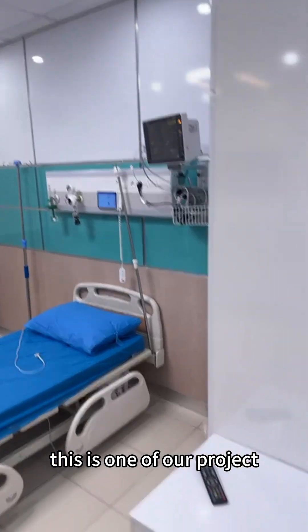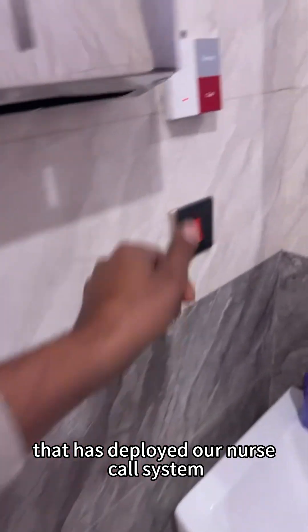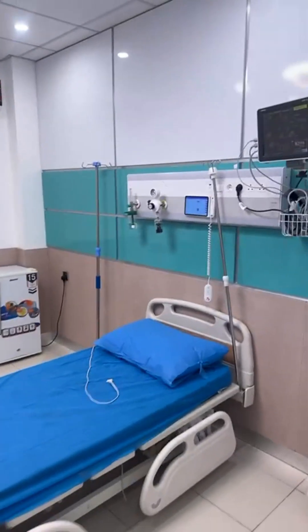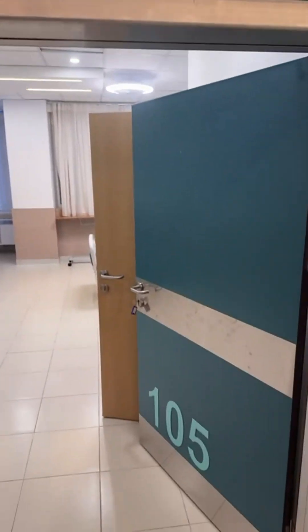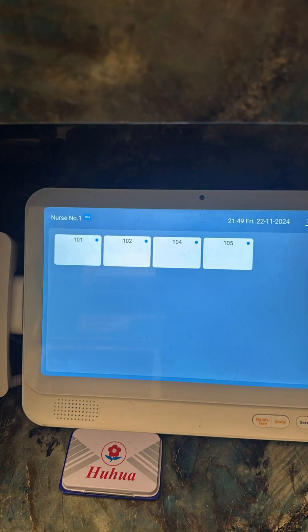This is one of our projects that has deployed our nurse call system.